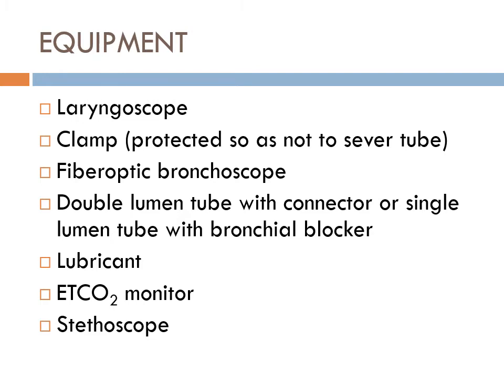There's also another piece that's supposed to go on here. I want you to see that as well. If you look in that box up there, there's a piece that could go in here for some passive insufflation. Now every device is different, but basically the premise is, let's draw the lungs, and then I superimpose these devices on the lungs. There you go, make my life a little easier.